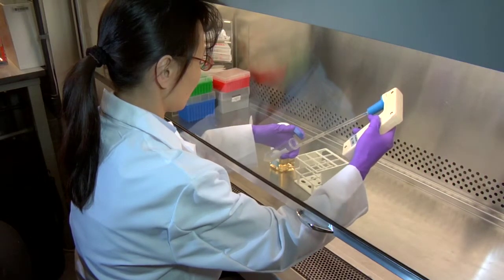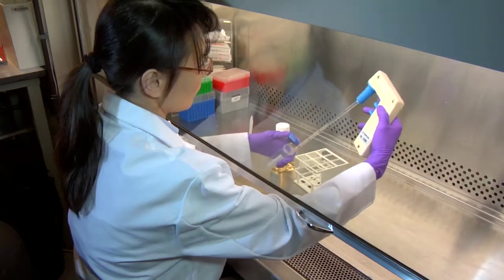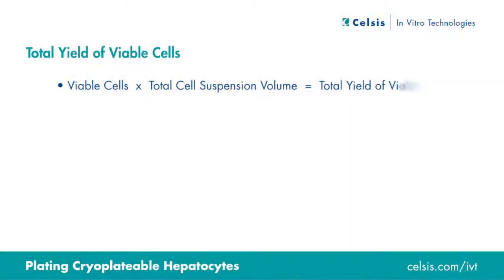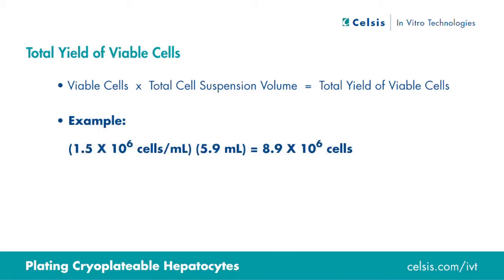Now we measure the remaining volume of cell suspension with a serological pipette to get an accurate volume measurement. Theoretically, the volume of cell suspension remaining would be 5.9 milliliters. To determine the total viable cell yield, the cell concentration of 1.5 times 10 to the 6 cells per milliliter is multiplied by 5.9 milliliters for a total cell yield of 8.9 times 10 to the 6 cells.